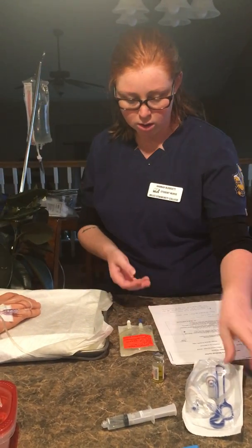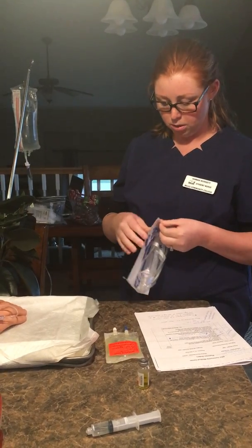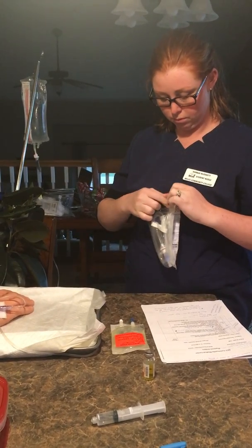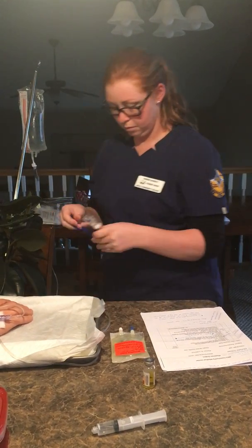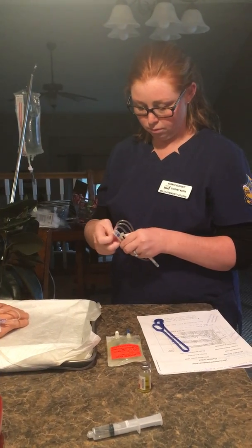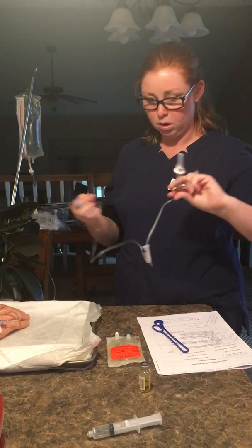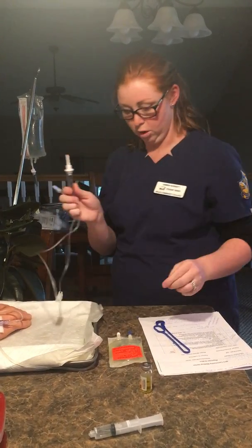Then I'm going to go ahead and mix that up really good. And then I can go ahead and open up my tubing. So now I'm going to go ahead and open up my piggyback tubing.